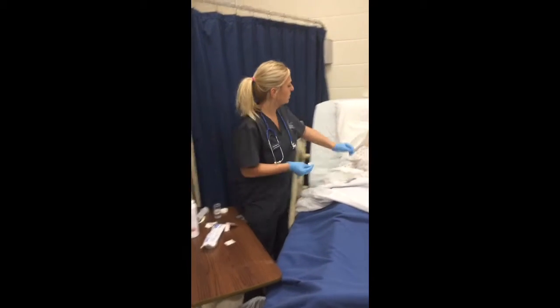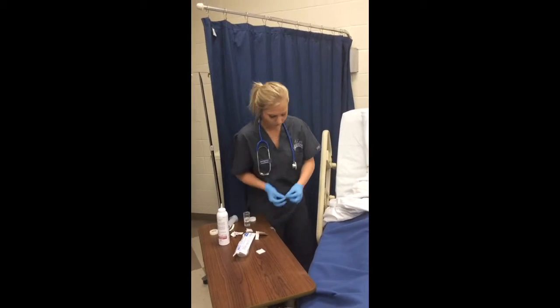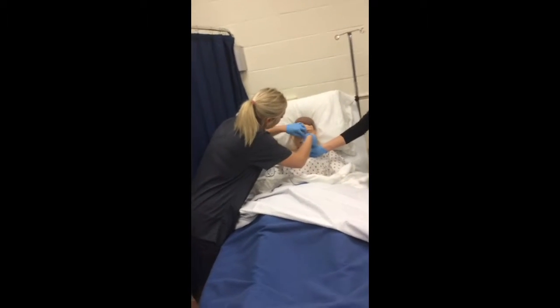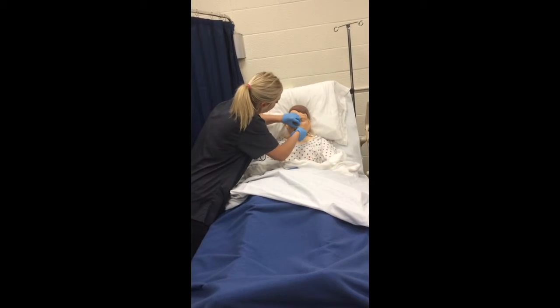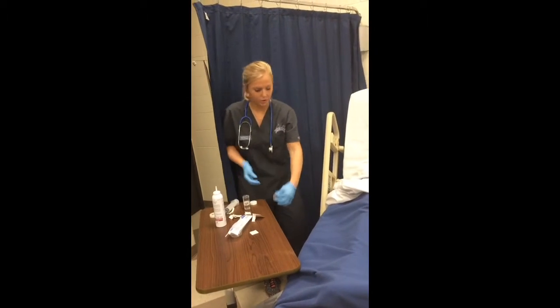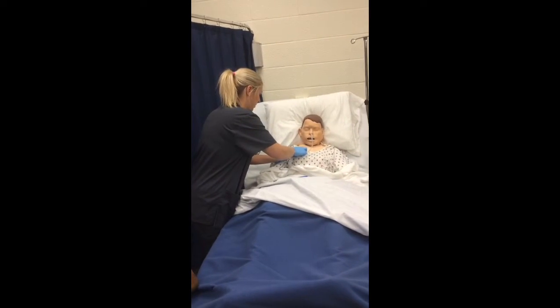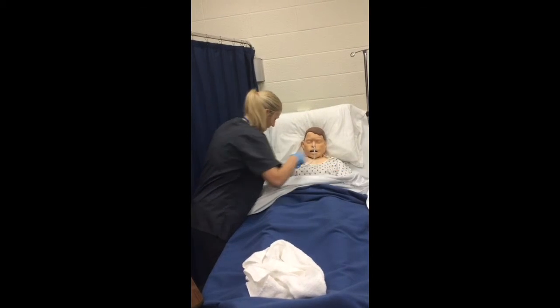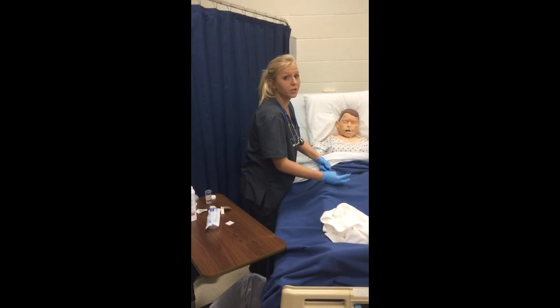I'm going to wipe the patient's nose off just to make sure that our tape sticks well. As it dries, we are going to tape it to the nose and around the tube. Alright, and we are going to tape the tube then to the patient's gown. We're going to lower the bed. At this point, we're going to either clamp the tube off or apply it to suction or a feeding tube.